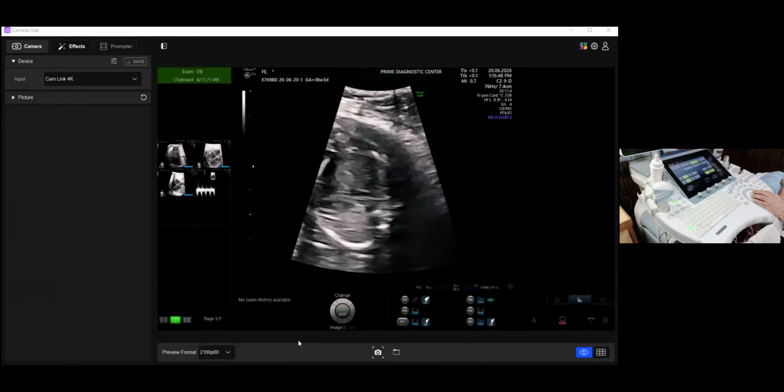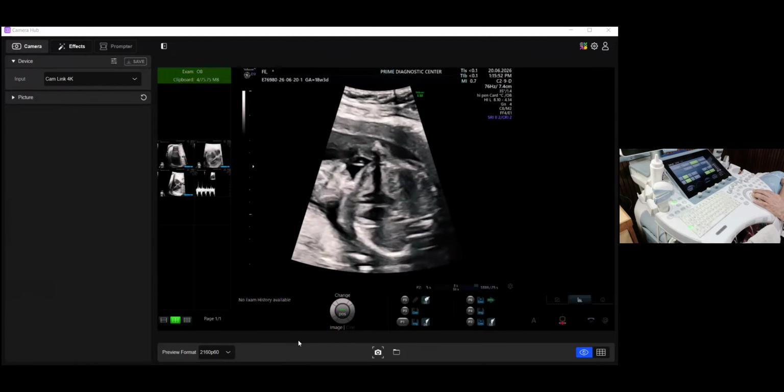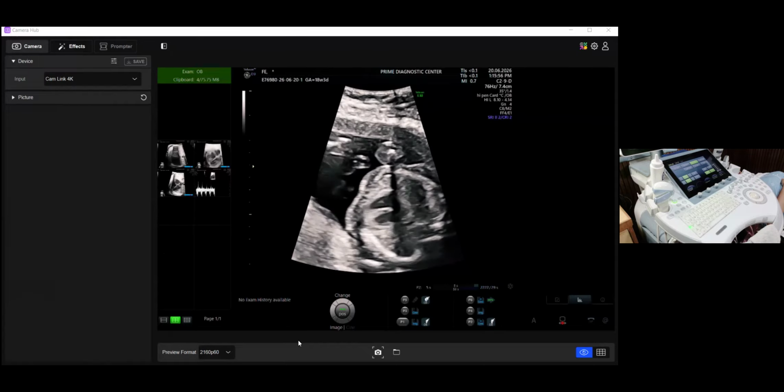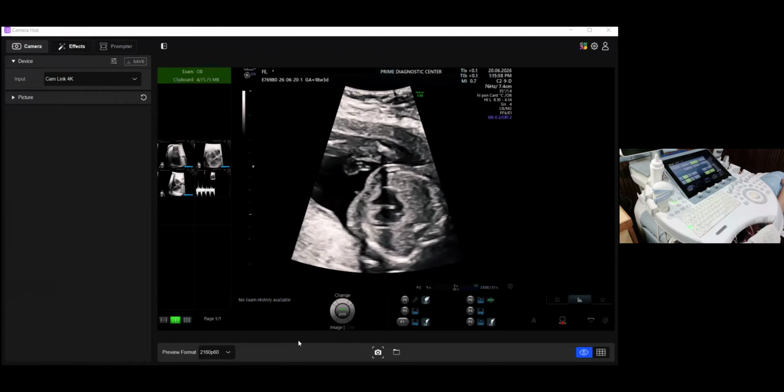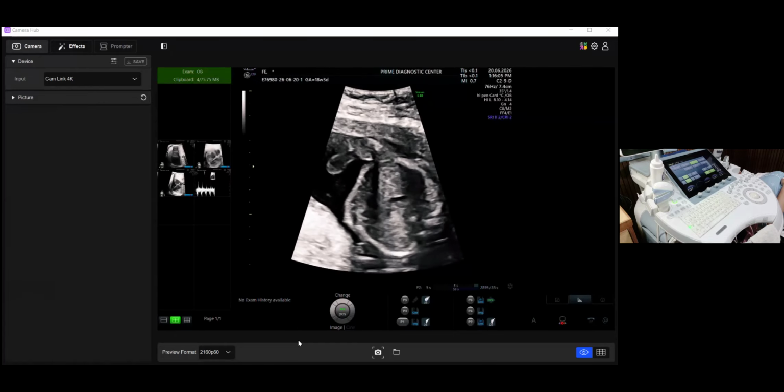And we go to the 4-chamber view, and in case you are interested to see the arches, the best is that the apex should be at 3 o'clock, 4 o'clock position, or 2 o'clock, or on the other side 9 o'clock, at the position where you get it better.